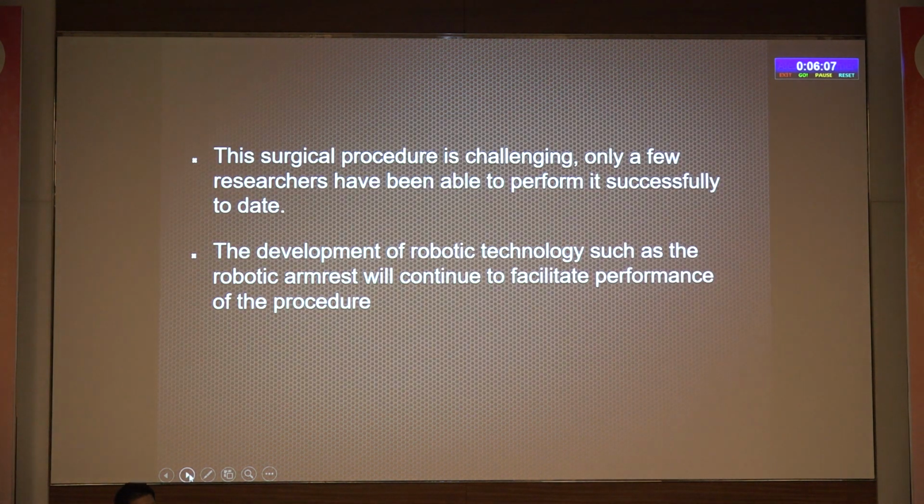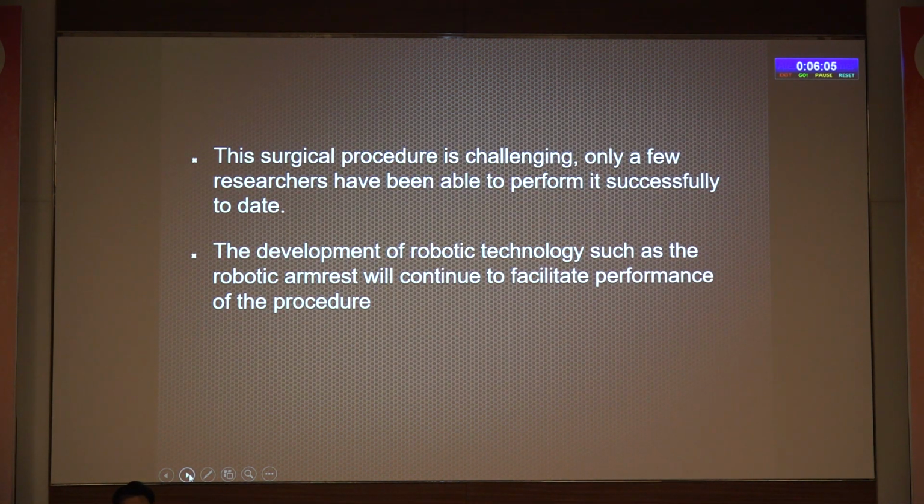Now, many a time people have asked me, if you see the thrombus on the central retinal artery, can you just nick the CRA and remove it? I have done that in a couple of cases, and believe me, the hemorrhage is not too bad. It settles down within 10 minutes, and the next day you really don't get the massive vitreous hemorrhage that we would expect.